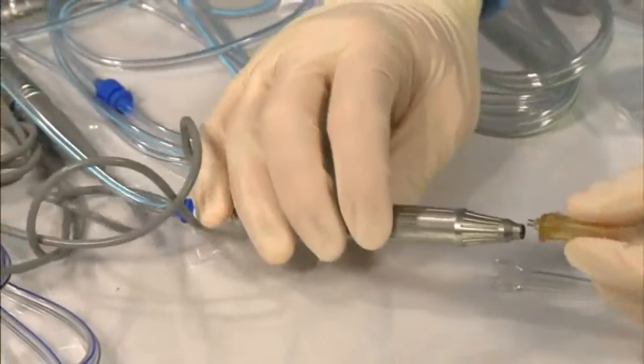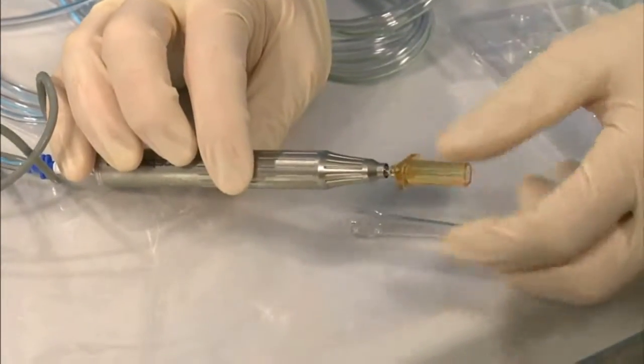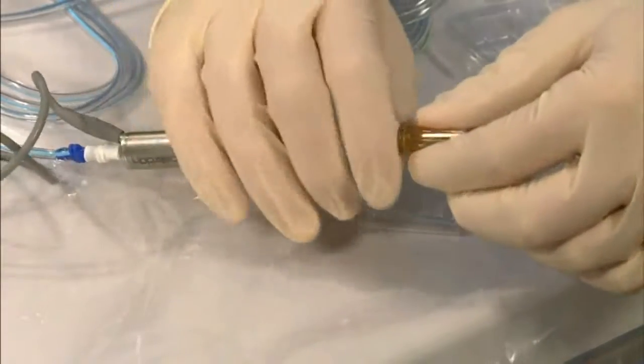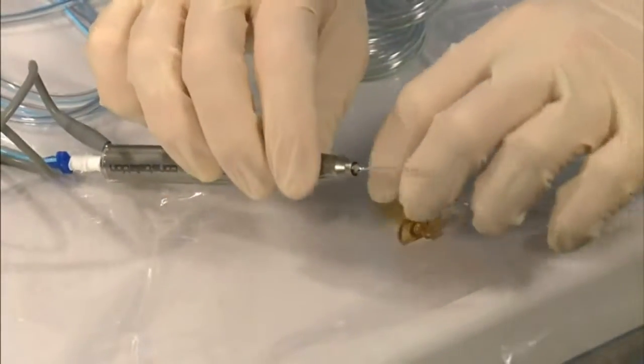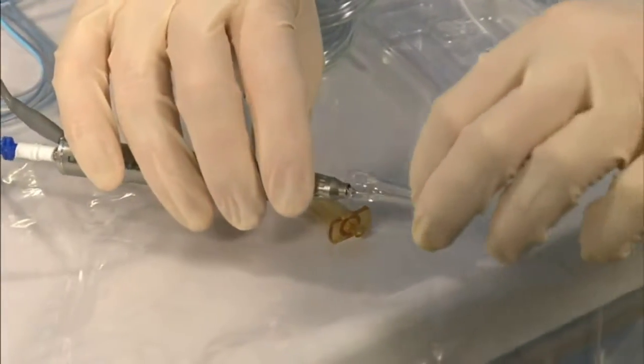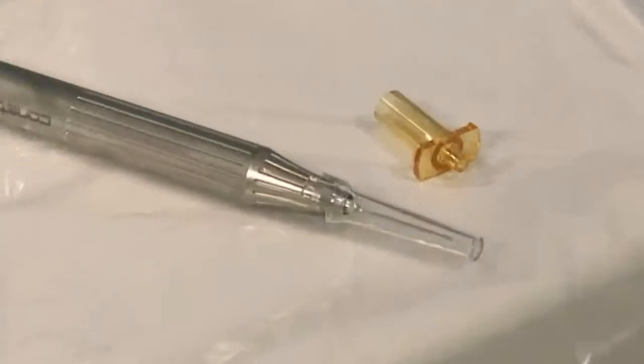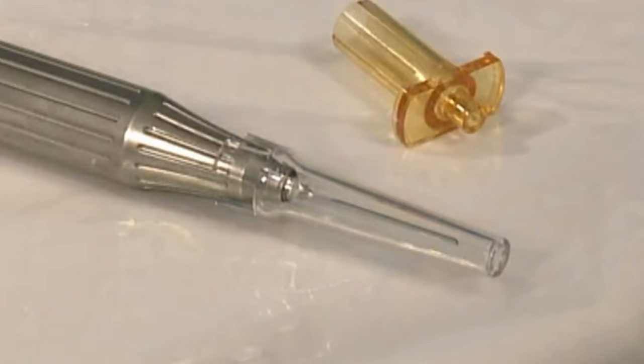Attach the fragmentation tip to the handpiece. Attach the tuning tip cover over the fragmentation tip and onto the front end of the handpiece. Ensure that the tip is not in contact with the cover and that the tabs are engaged by means of a positive snap for secure attachment. The handpiece and tip is ready for priming and tuning.